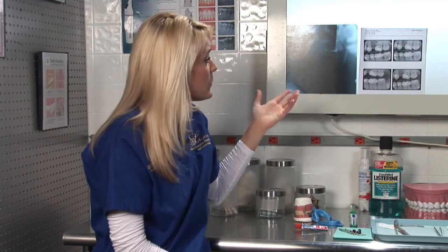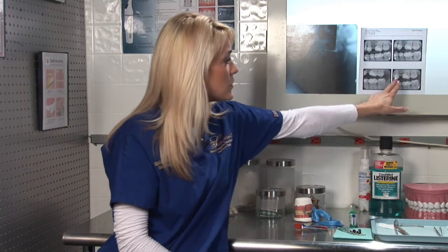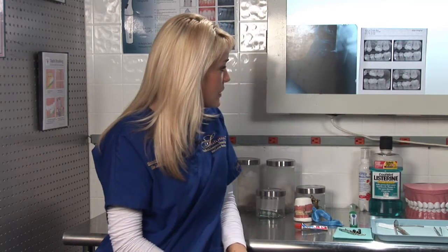For adults, we take a series of four bite wing x-rays so that you're able to catch the back molars and the front bicuspids, as you can see in this picture.